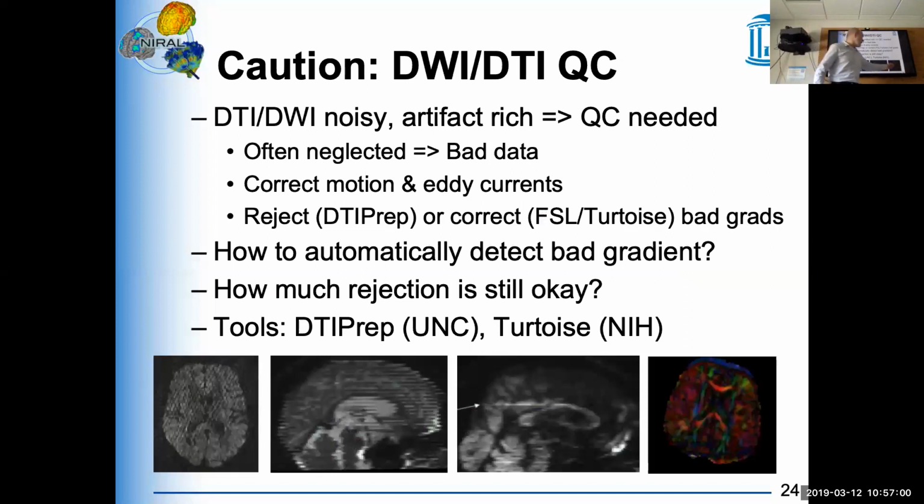Or in this particular case, this was a vibration artifact. Diffusion sequences are rather rough sequences. They are gradient echo. They really shake the scanner, so the scanner shakes and is very loud. But in this particular case, the patient bed started shaking with the scanner at the same frequency.